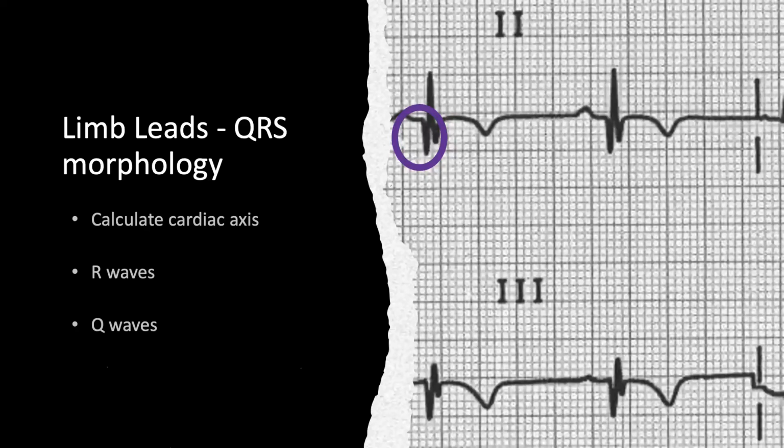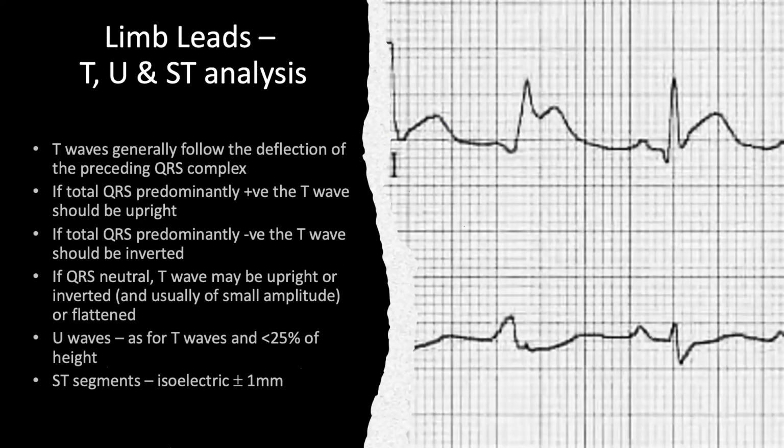And thinking about the R waves, just checking that they're present and which way they're pointing, and helping to form a cardiac axis for you. Carrying on with TU and ST.